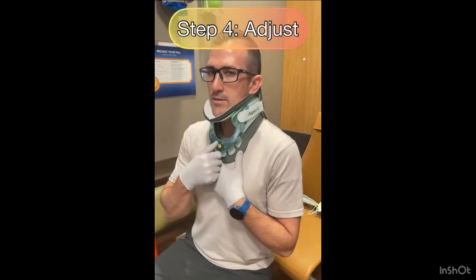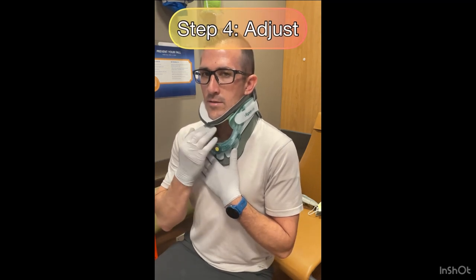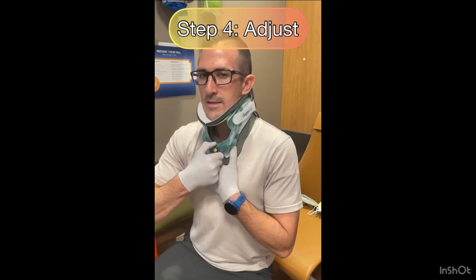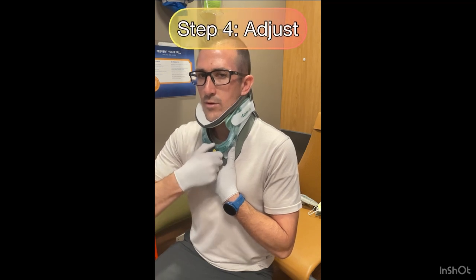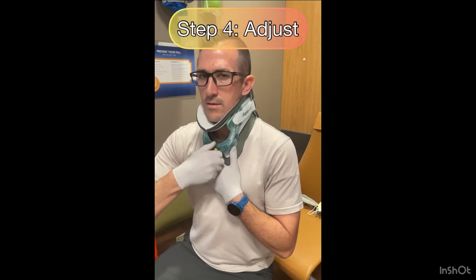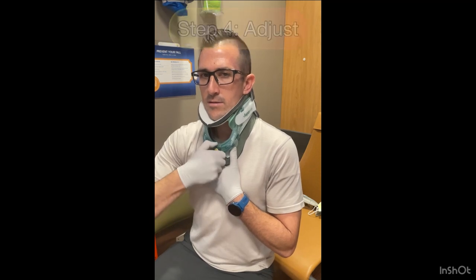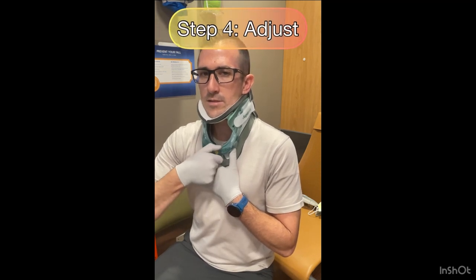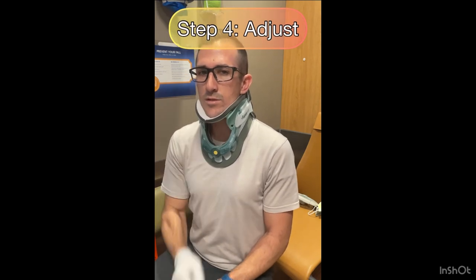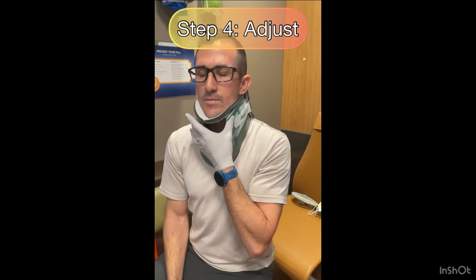There is one piece you need to be aware of: you can raise the chin piece to give more or less support using that little dial with the yellow circle on it. Pull it out and rotate it - turning it one way gives you a lot more room, while turning it the other way gives you much more support and holds your head up more.